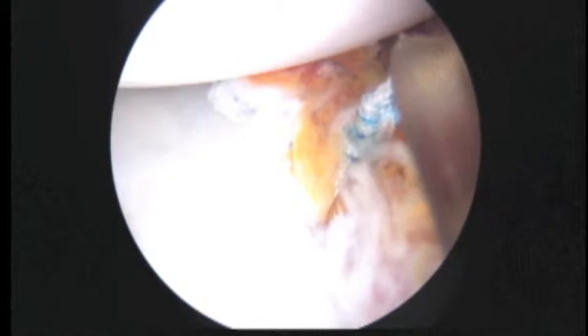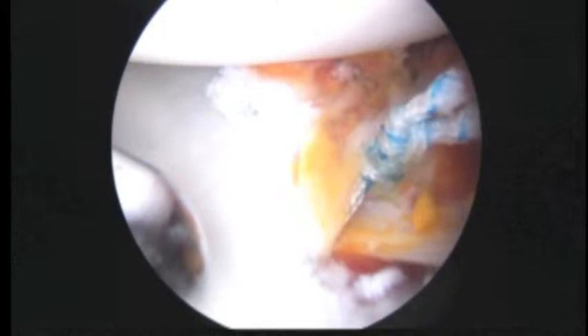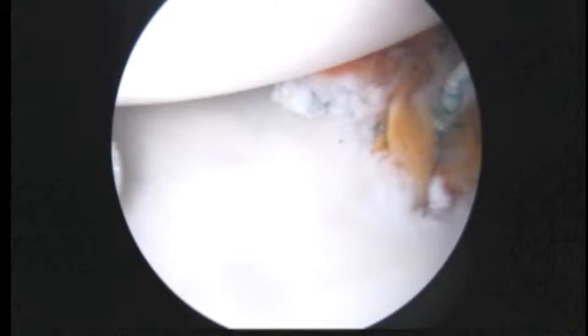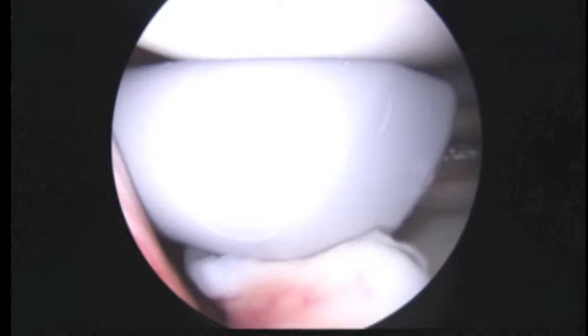We're going to have a look from the back just to make sure there's nothing else we need to do in the anterior superior region — usually there's not, but we want to confirm it. That looks like a pretty good tightening of the anterior capsulolabral structures. The next step is to go ahead and put the camera in the back, through the gray cannula. The middle glenohumeral ligament, and behind that the subscapularis.